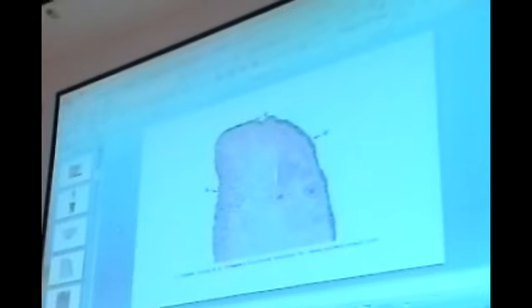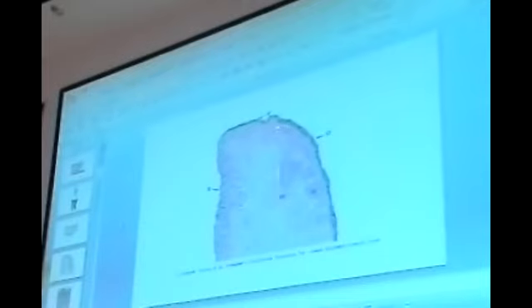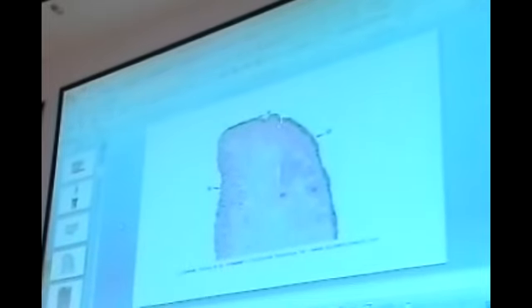Modified. Why? Its epidermis is transparent. It has high vascular dermal papillae with sensory receptors. There are no glands, or the glands are few in the upper lip, but forget about glands. So it is covered by modified skin.